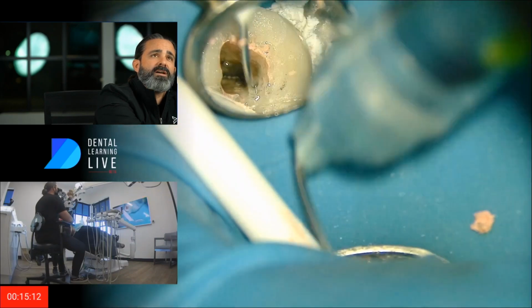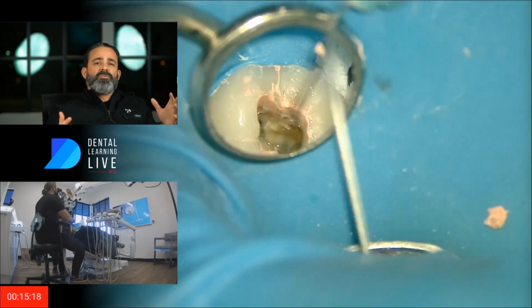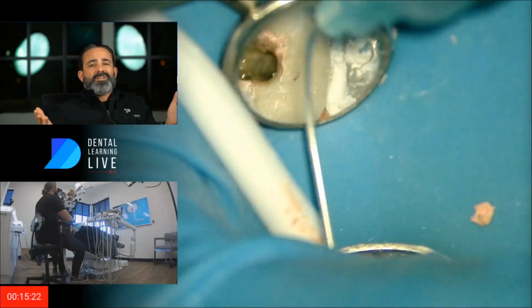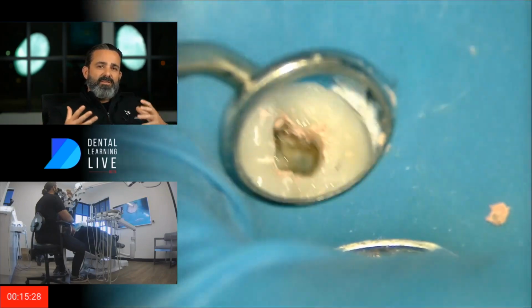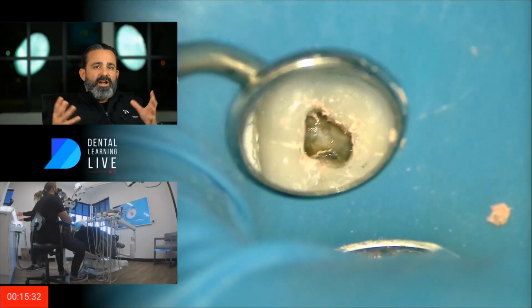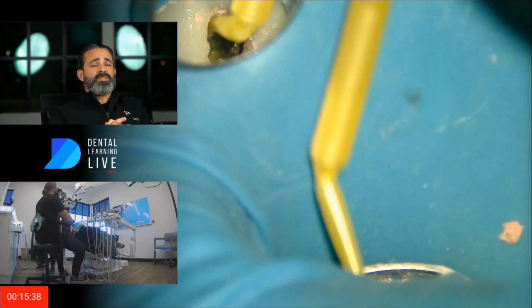And now, once you get to a certain point and you want to clean up some of the mess, sometimes I'll go midway through the removal process of the gutta percha. I'll go right to isopropyl just because I can, and I want to be clean, and I want to really see if I'm getting everything out of it. A lot of times there are aberrancies in that traditional file shape. Aberrancies meaning some sort of undercut or interconnectivity with the sealer and the gutta percha.